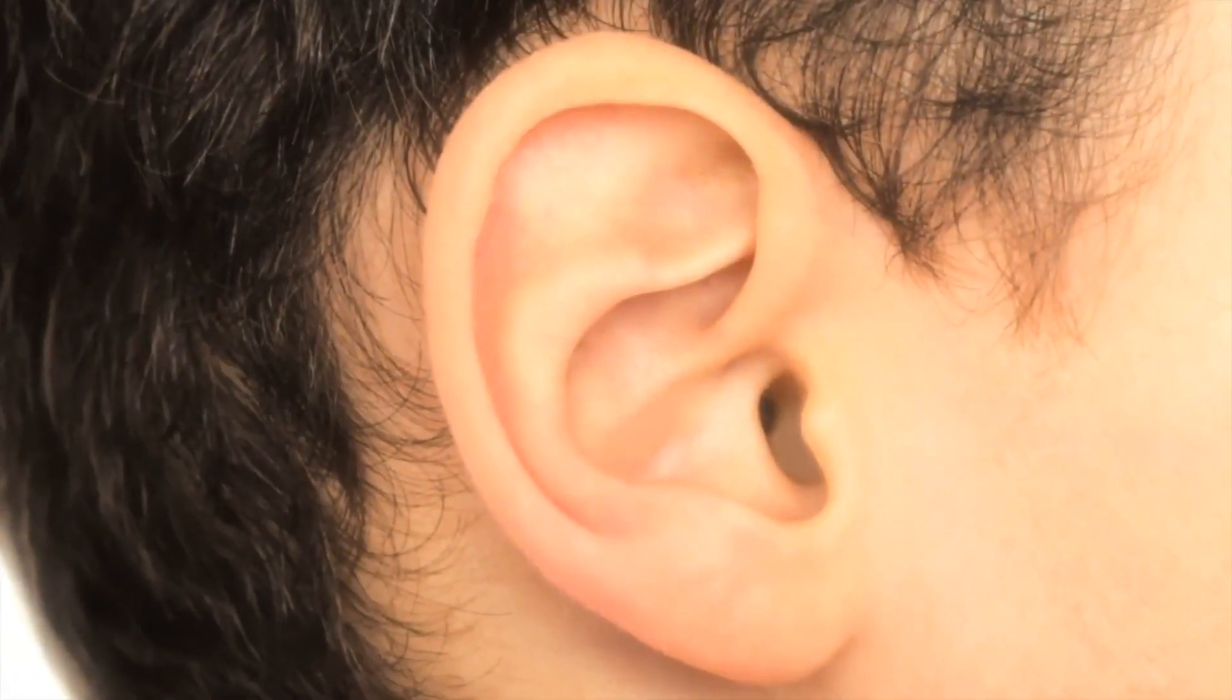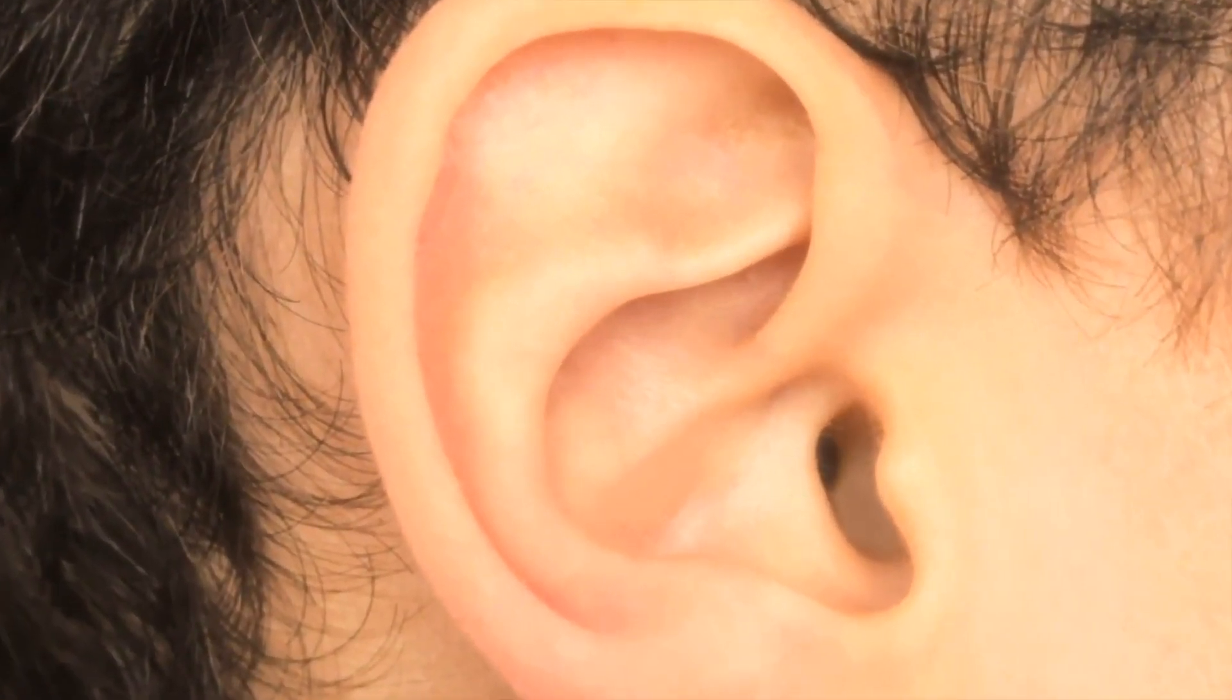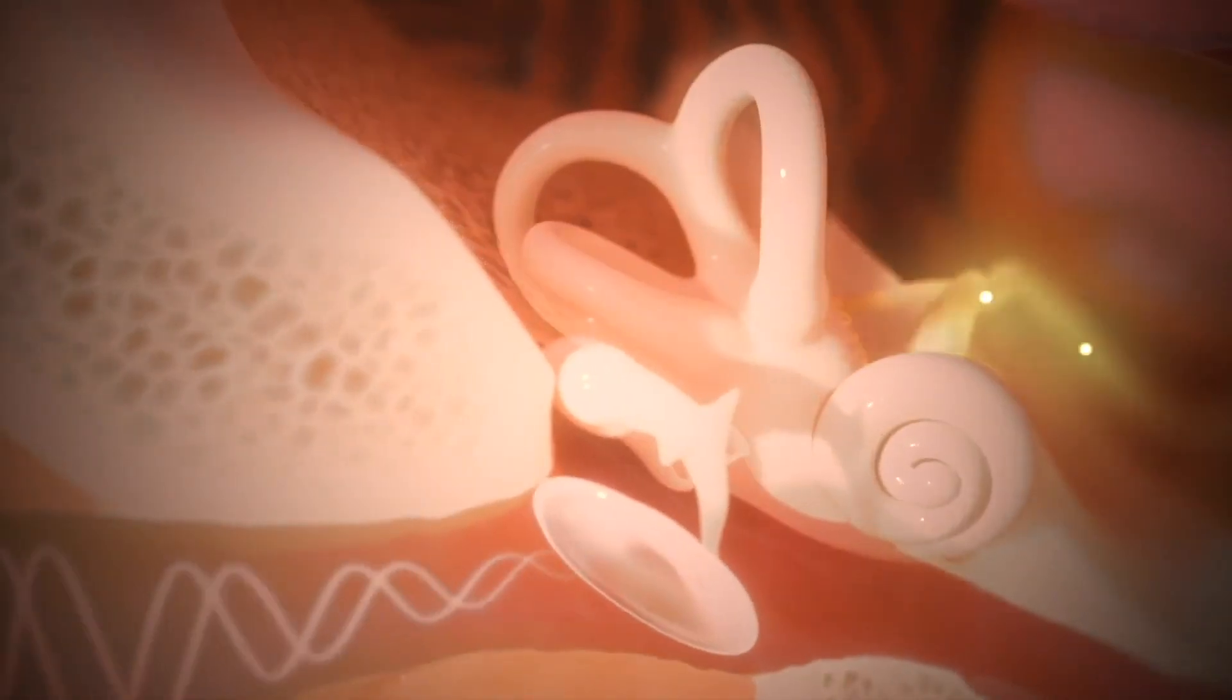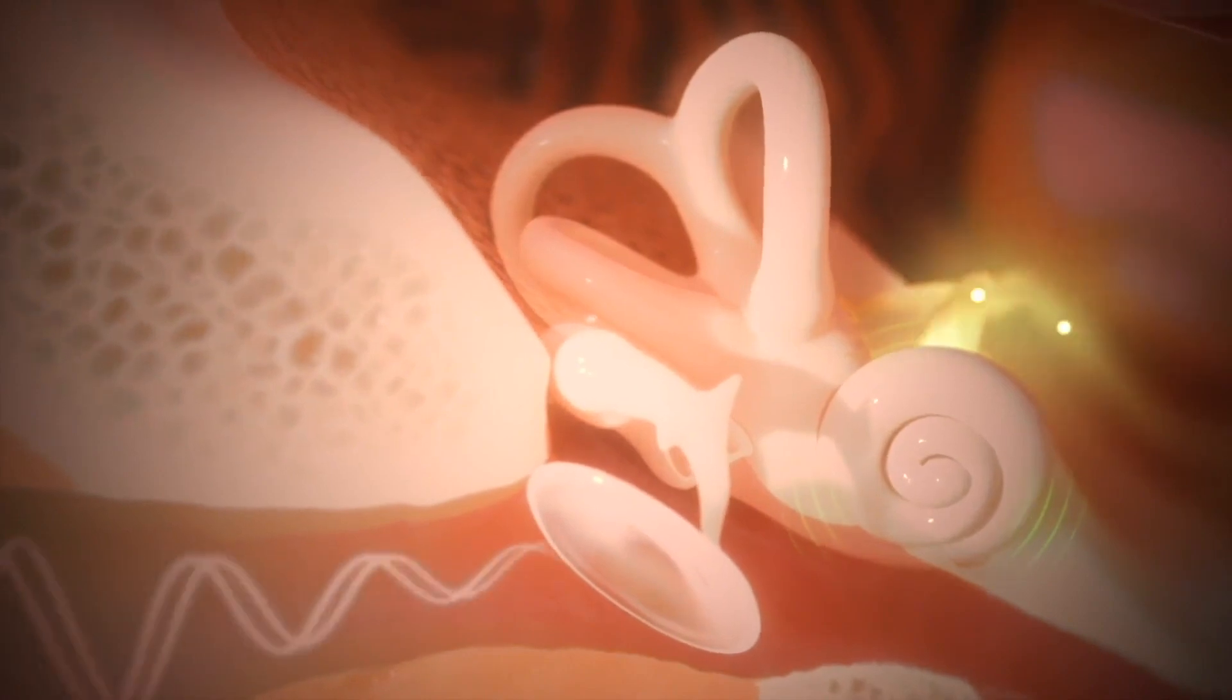The cochlear is a tiny shell-shaped structure inside your inner ear lined with thousands of sensory hair cells.